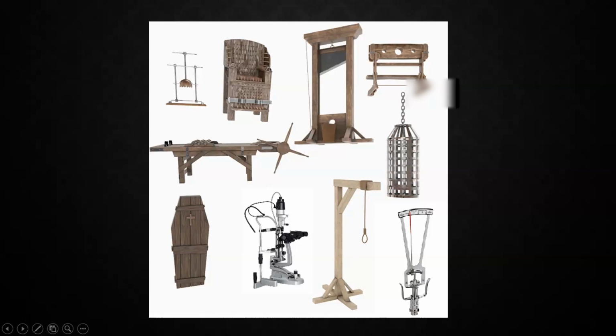On top of that, like I was talking about, ophthalmologists are seasoned at this. They do tons of these exams all the time. We are not doing these 20 plus times a day. And so I do feel like sometimes these exams are low yield and I can't quite see what I want to see when I'm trying to do a fundoscopic exam or use the slit lamp. So ultrasound just brings that physical exam to the next level, especially in the emergency department.